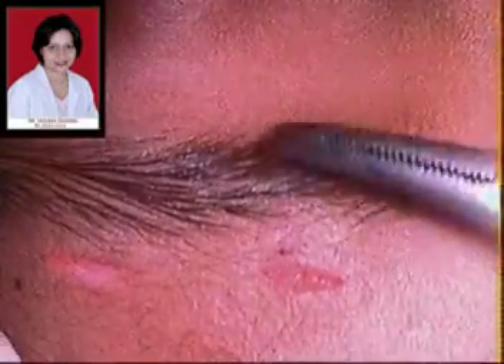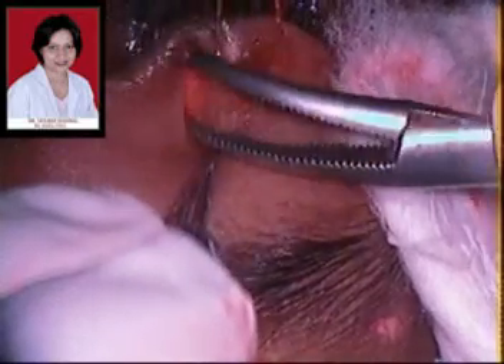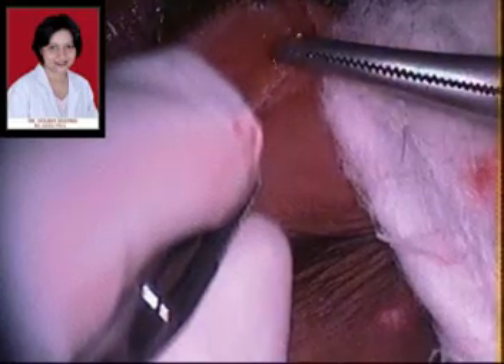Similarly, the suprabrow incisions are also deepened to allow good burial of the knots subsequent to the surgery. In bilateral surgeries, symmetry is the most important factor, and both eyelids are being done here simultaneously, with incisions being made first on one eye and then in the other.